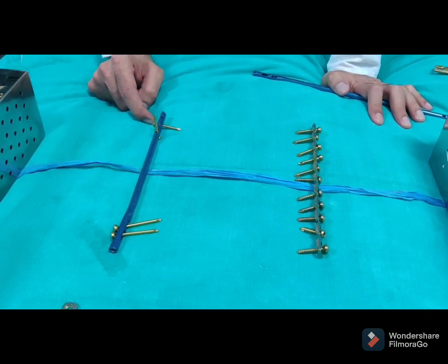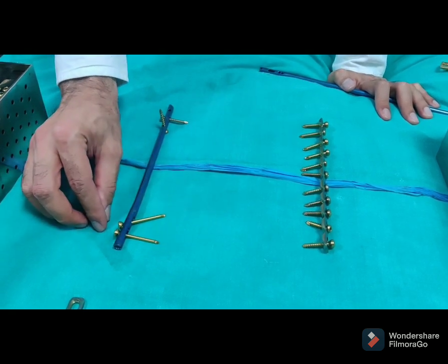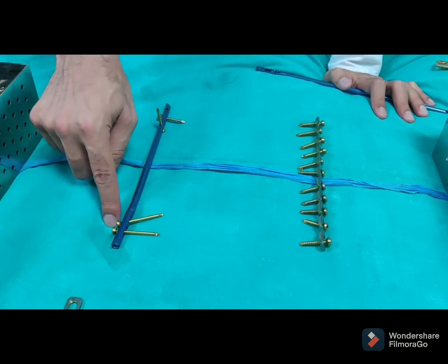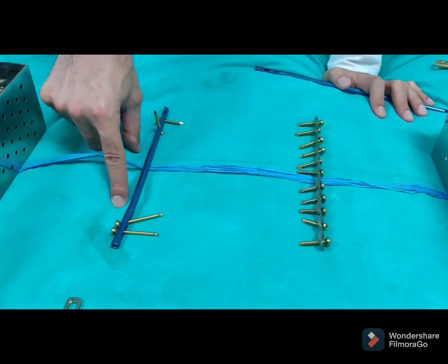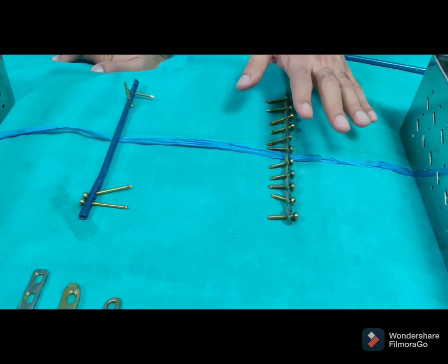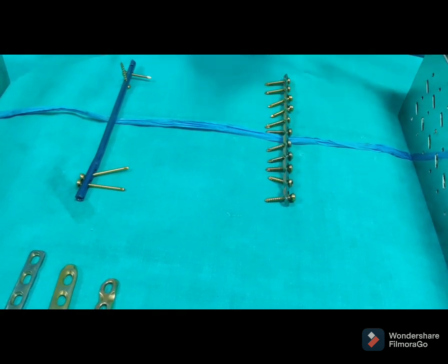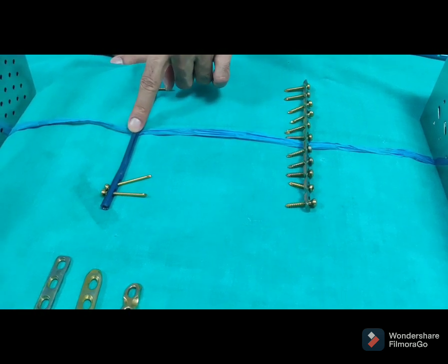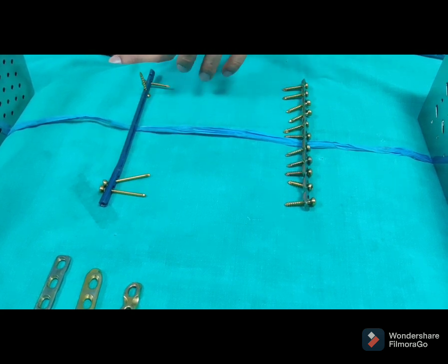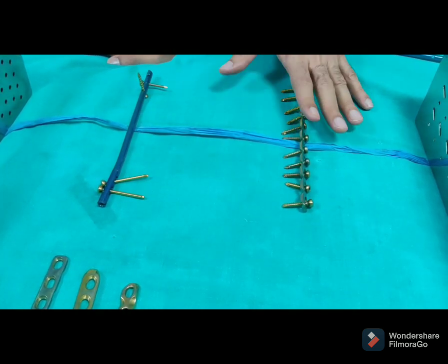What is the advantage of this procedure? We don't damage the muscle — this is the MIS (minimally invasive surgery) technique. When we put a plate, we can't start physiotherapy from day one because the muscles are damaged and the patient has pain. But when we put a nail using MIS technique, we can start shoulder and elbow exercises immediately. So this is why the joint does not become stiff or develop frozen shoulder. These are the advantages of the nail implant.